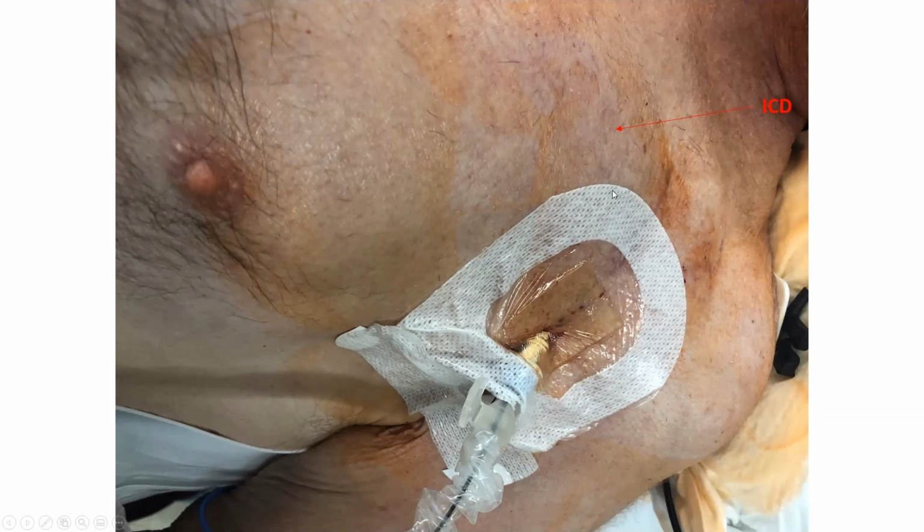This is an image. This is not an ideal stick. Like I said, you stick on the anterior chest, typically below the middle third of the clavicle, and always on the inside of the deltopectoral groove. Here we stuck on the anterior chest, but at the edge of the deltopectoral groove. Because of that big ICD, we had to stick more laterally than we wished, possibly at the junction of A2 and A3. Right axillary access may be advantageous in patients who have an ICD on the left because there is less risk of sticking too laterally.